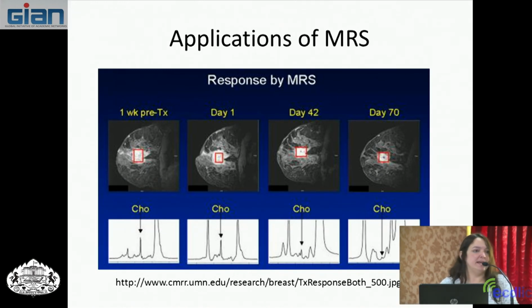I'm assuming in this case that the choline levels are related to the tumor properties in the tissue. So they want to monitor if this treatment is actually working, and they're using this technique to see that.